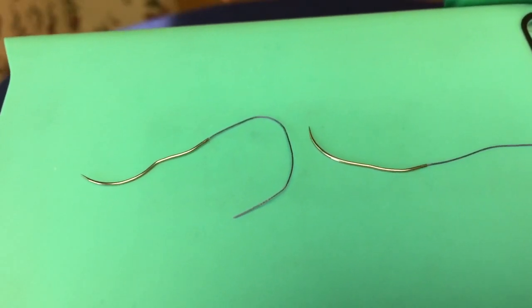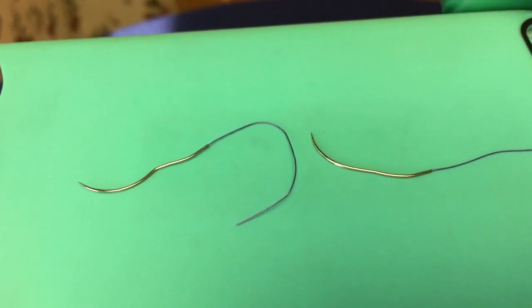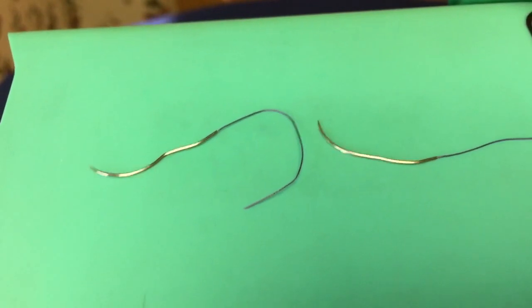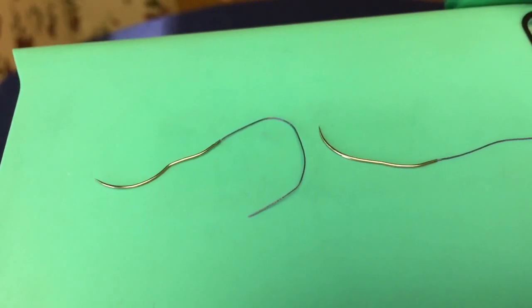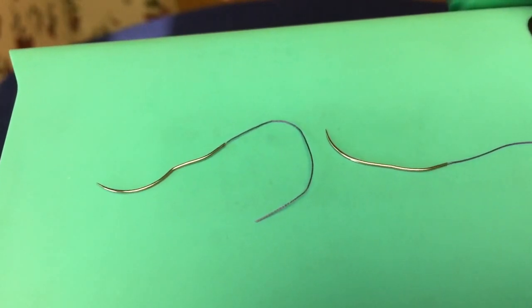Remember when you try to push curved needles straight through tissue, it will bend — this is what it bends like. You can see it bends where the needle holder is. This also happens if you are using a needle that is not heavy enough for the tissue that you're going through.